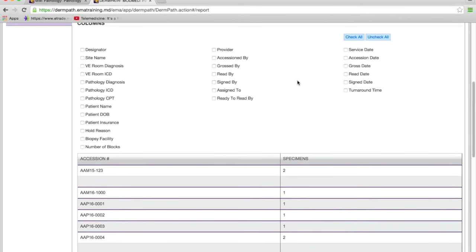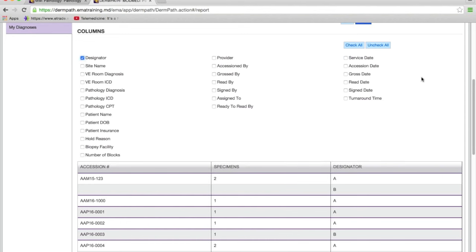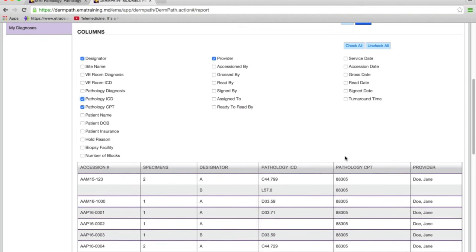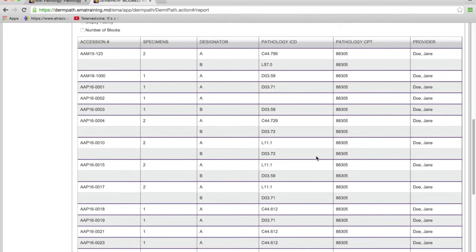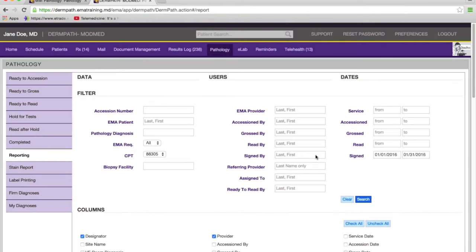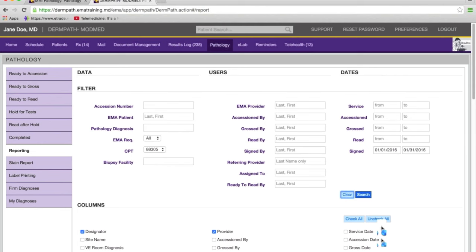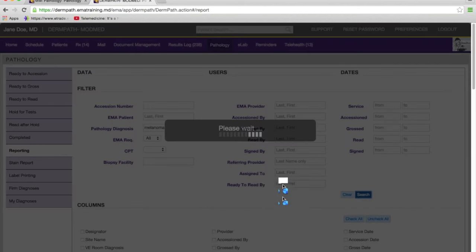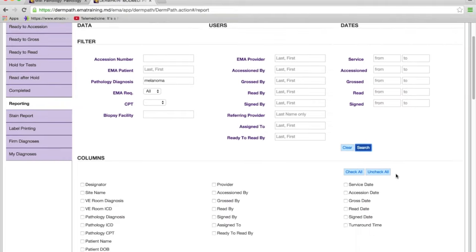Here you go — you get all the results back with the accession number and specimen. Then you decide what data you want to see: the designator, the ordering provider, the pathology CPT, the pathology ICD — you can add any data you want to that view. For example, let's clear this and search for all melanoma cases in the system — you search by pathology diagnosis and say search.